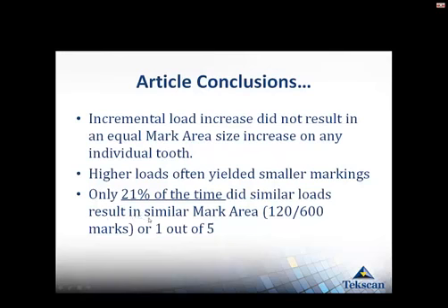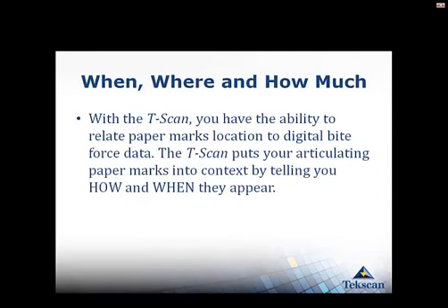And then the third thing here is that 21% of the time, similar loads resulted in similar mark size. So really, one out of the five times. 79% of the time, it didn't result in the same mark size. I think that's important. It opened my eyes, and I think it will open yours as well.